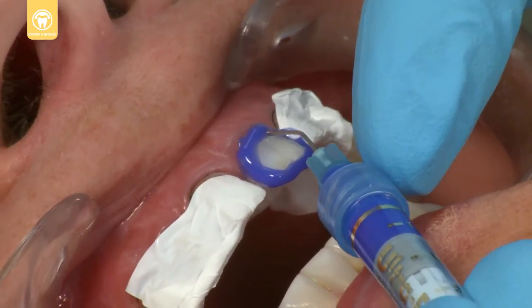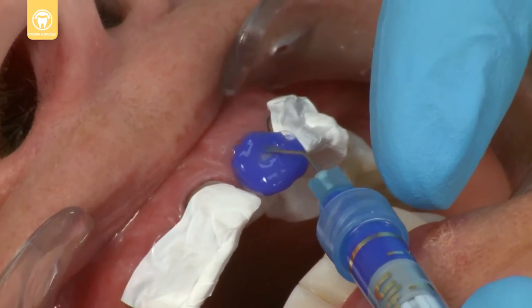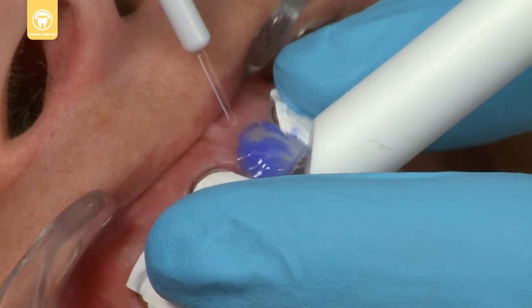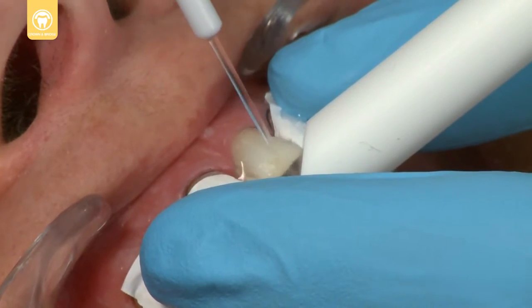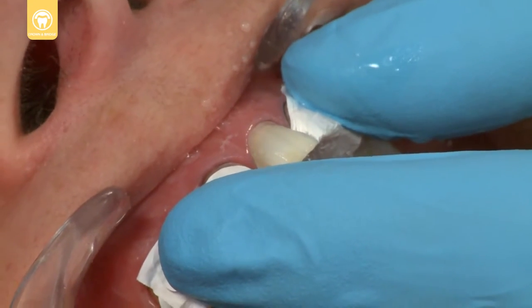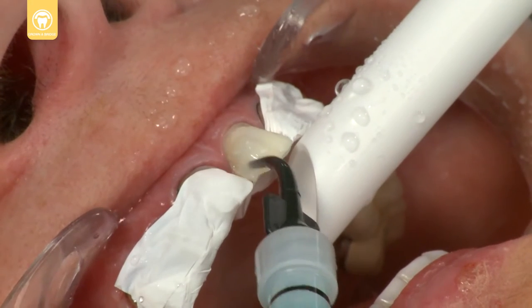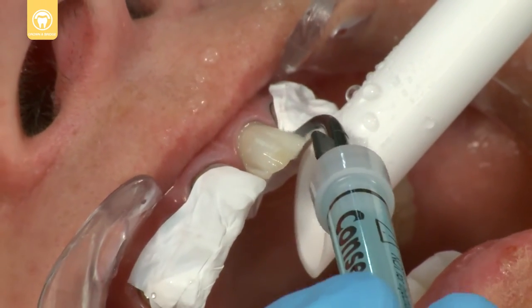Apply Ultra Etch to enamel and/or dentin for 20 seconds. Rinse thoroughly for 5 seconds and leave damp. Optional step: disinfect the area with Consepsis and lightly dry.